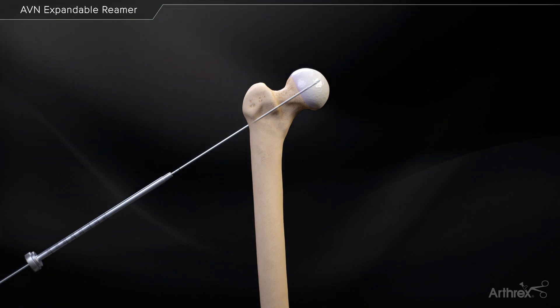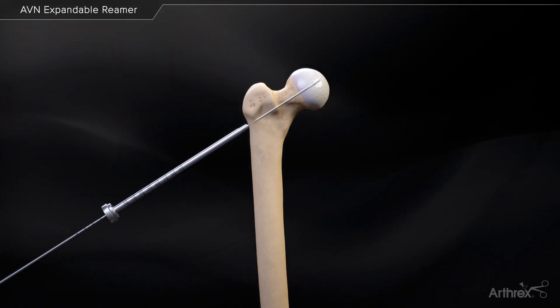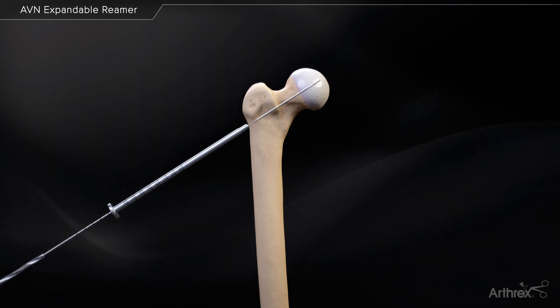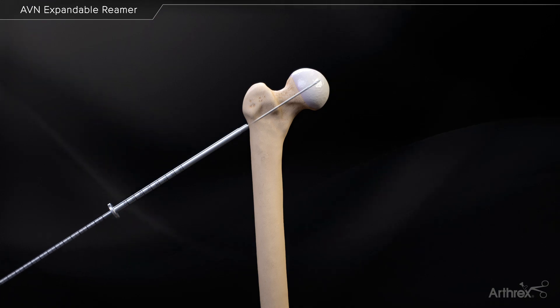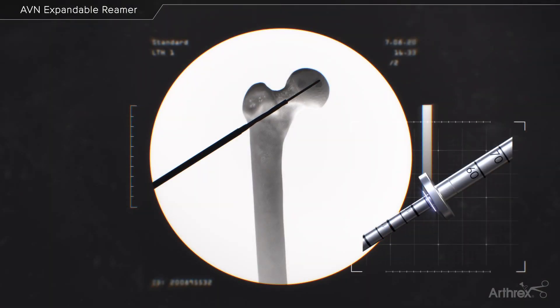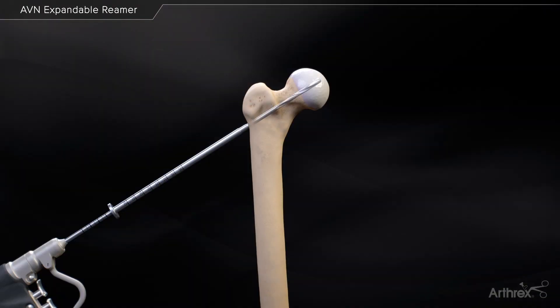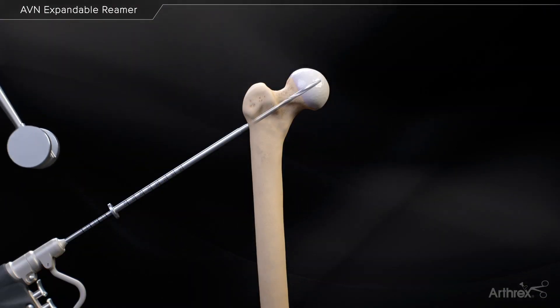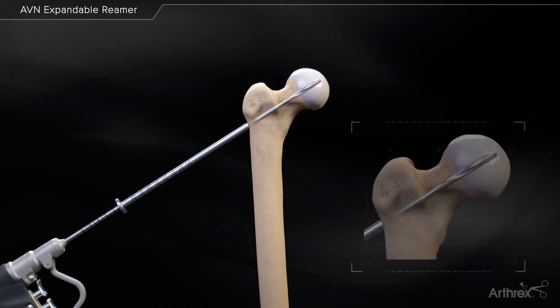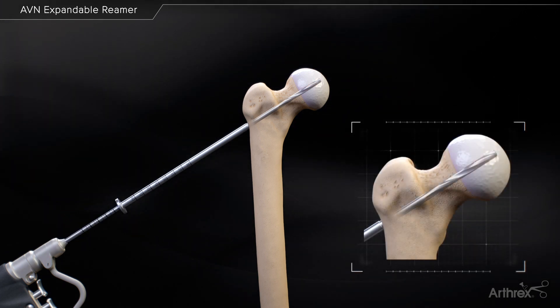Slide the 5 mm drill sleeve over top of the 2.4 mm drill pin back up to bone. Advance the 5 mm reamer under fluoroscopic guidance to the same depth as the previously placed 2.4 mm drill pin. Mallet the drill sleeve 10 mm into the lateral cortex and ensure it maintains the same trajectory as the cannulated reamer.